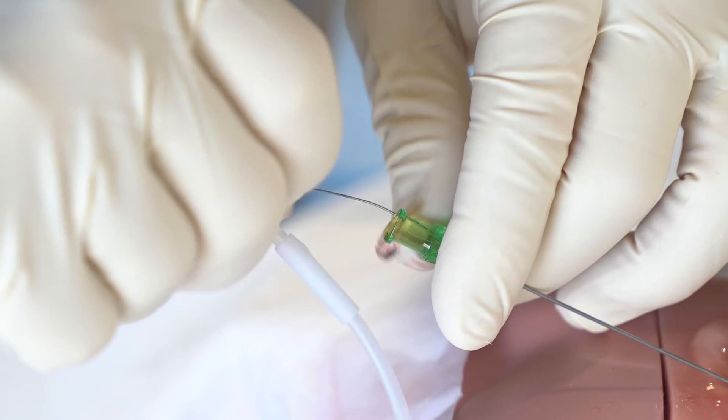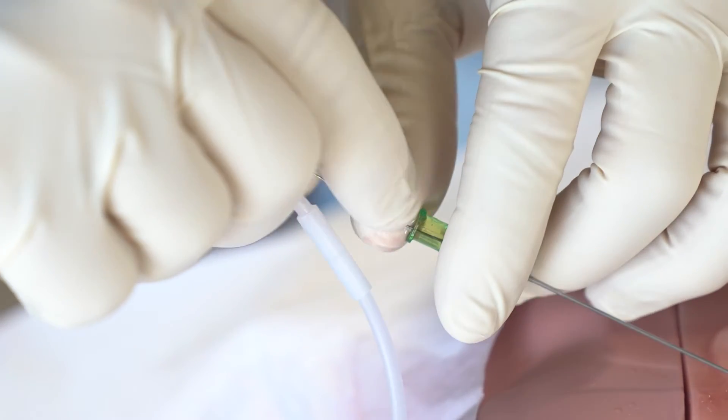Once in place, remove the needle over the wire, maintaining control of the wire throughout this process.